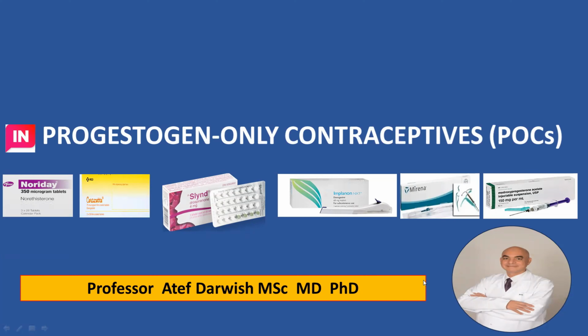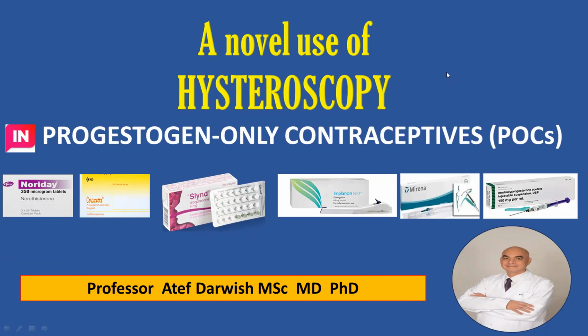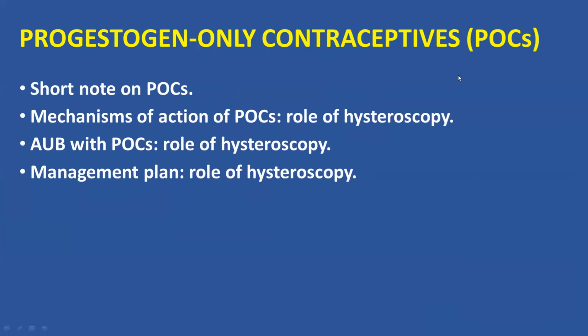Today, I would like to add to your experience and your practice a new indication of hysteroscopy in the office in your clinic when you are dealing with a case of abnormal bleeding with progestogen-only contraceptives. And this is actually a novel indication of hysteroscopy in the field of contraception.